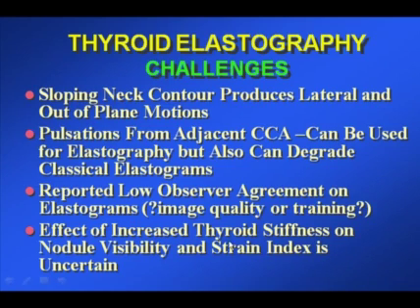Of course, if you're using thyroid tissue to calculate your strain index and the thyroid itself is abnormal, you may end up reducing nodule visibility and get abnormal strain index values that are not reliable for detection of cancer. So this all needs to be evaluated still.